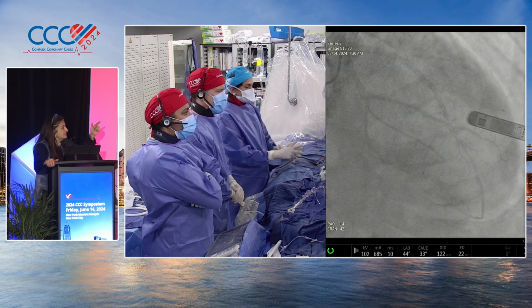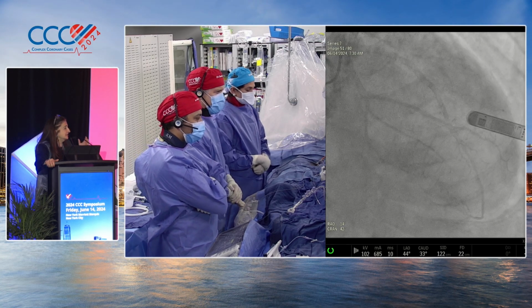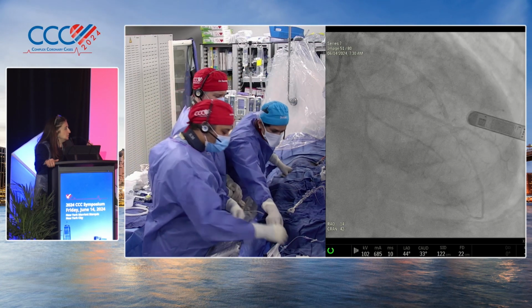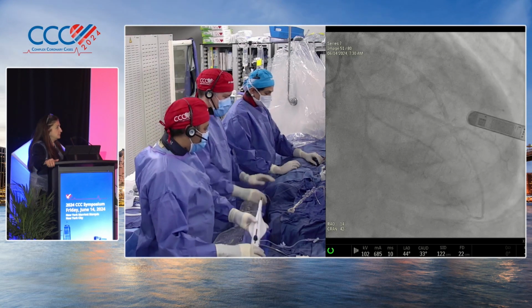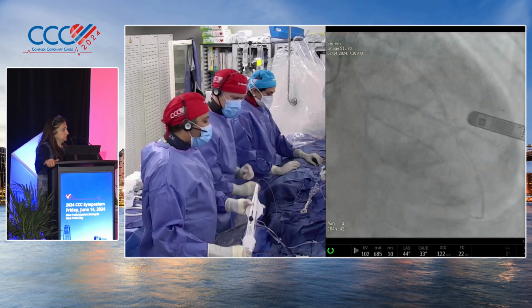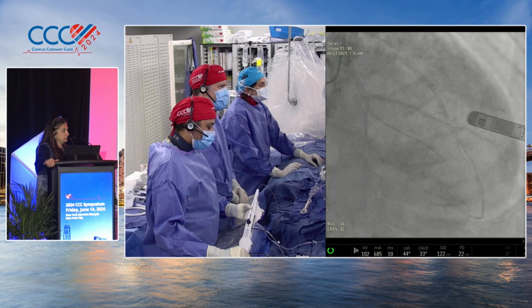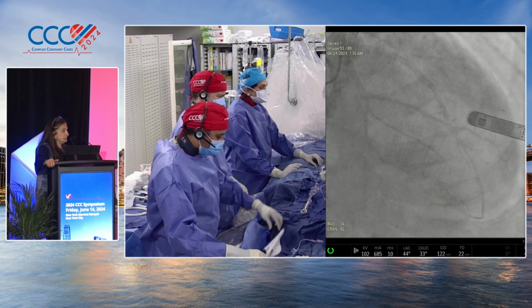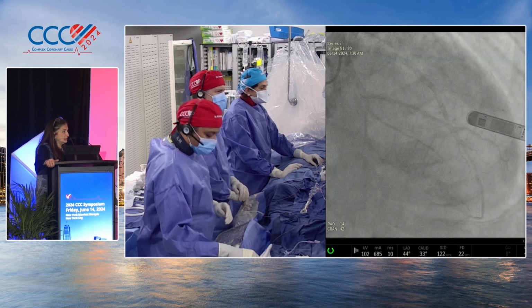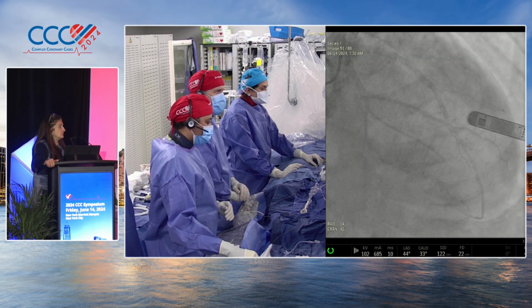Dr. Itchaporia is going to debate Greg Stone later today about the use of protective devices. How would you approach this, Dr. Itchaporia? Yeah, I agree. I am worried about that aortic valve, and I think doing a valvuloplasty and then seeing what the hemodynamics are right after that. But I certainly wouldn't rule it out. If you look at what I'm going to debate later, the pure data, this is about the CHIP score that Sharma mentioned earlier. This person has a high CHIP score, so you would say that support would be called for, but there's no clear data because we're still waiting for those results.